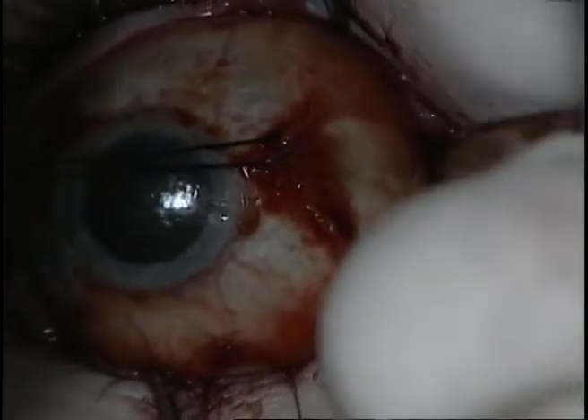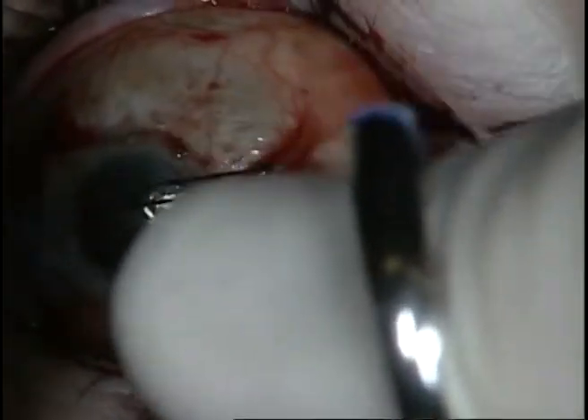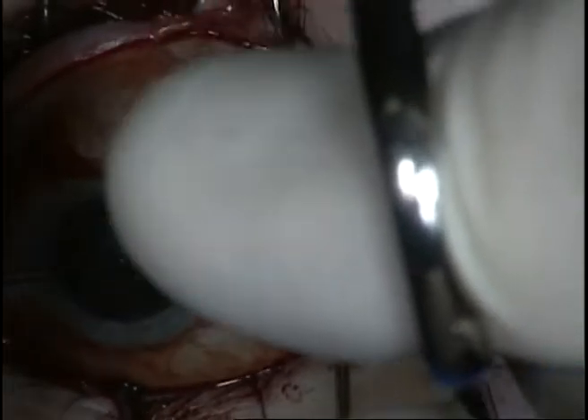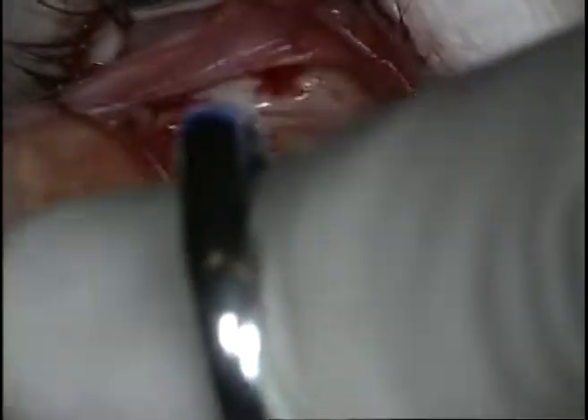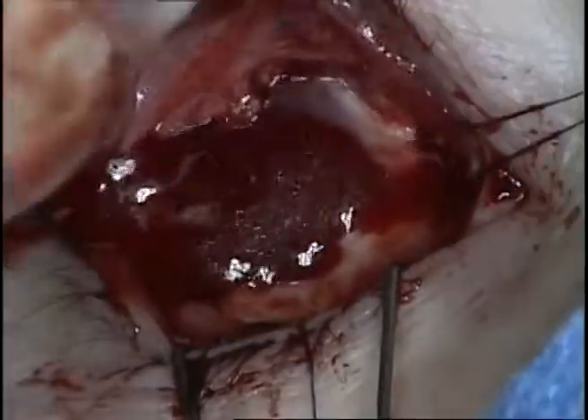The optic nerve is then approached from the medial direction. With the scissors closed, the nerve is felt from below and above, and then the blades of the scissors are opened and the optic nerve is transected. Posterior Tenon's capsule is detached from the surface of the globe.